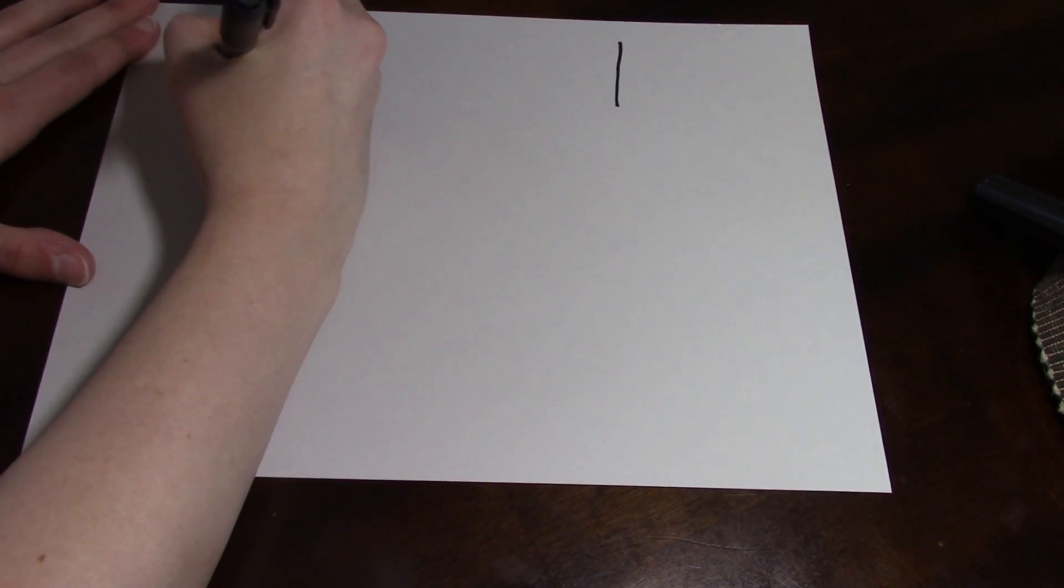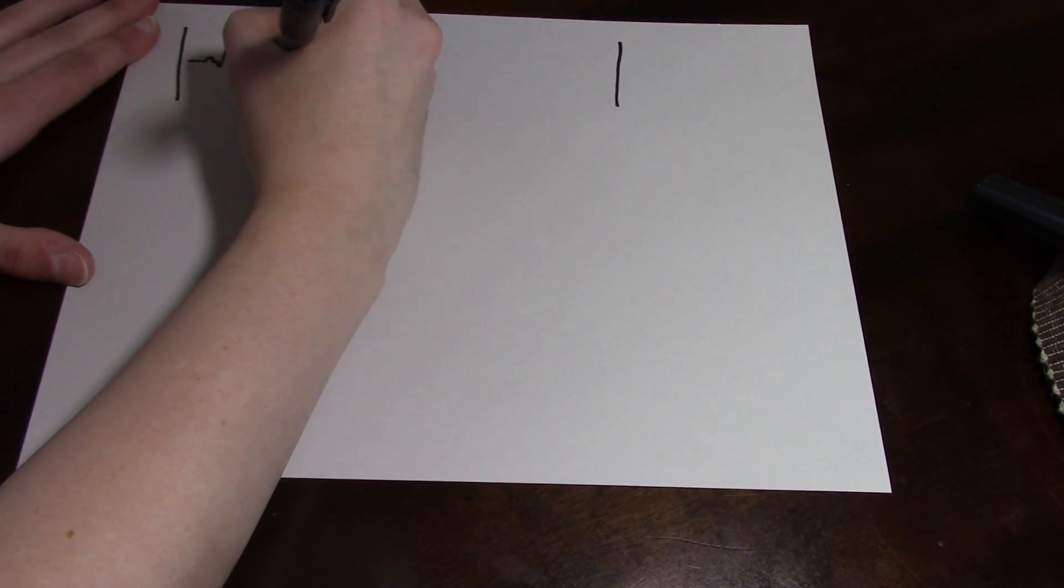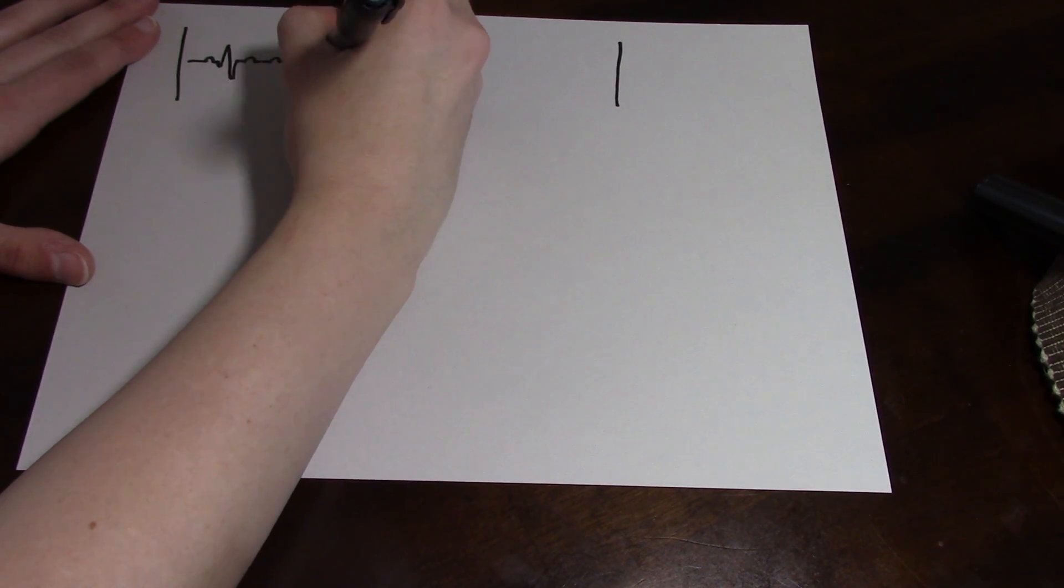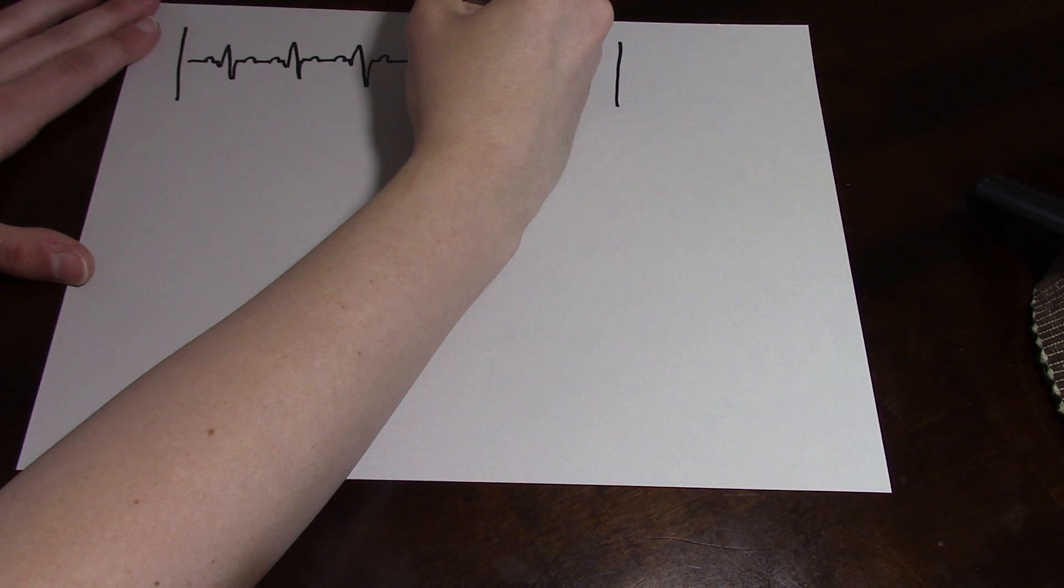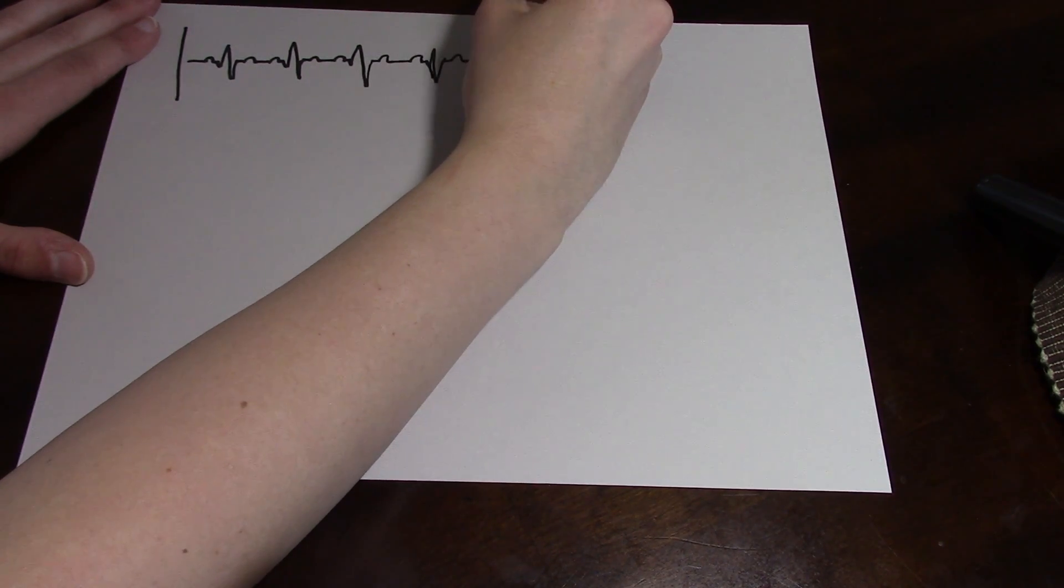Before we begin, it's important to know that when you're measuring how fast a rate of a heart rhythm is going, typically it's measured on a six second strip. And there's two ways that you can measure how fast this rhythm is going.